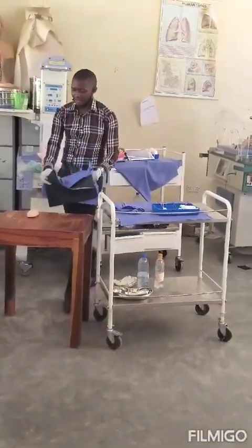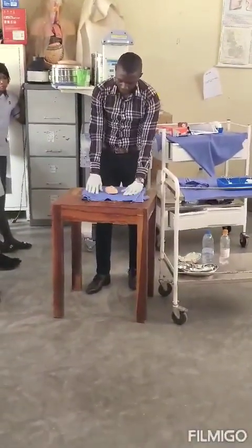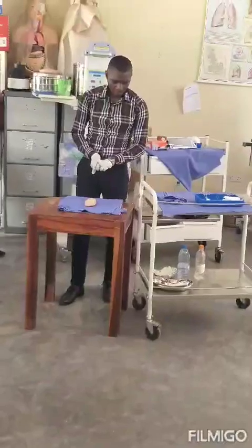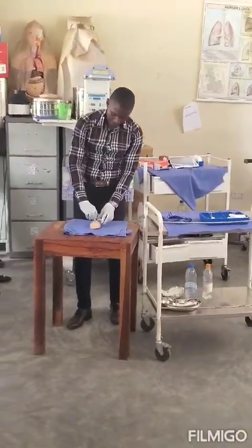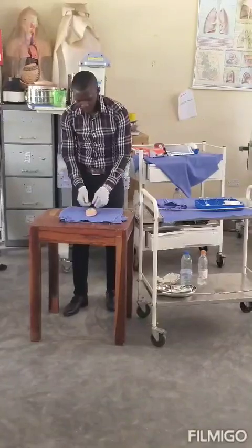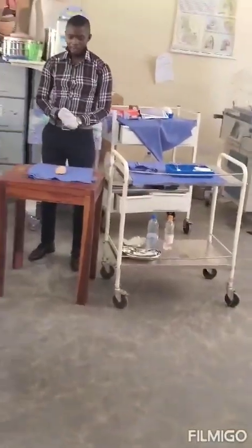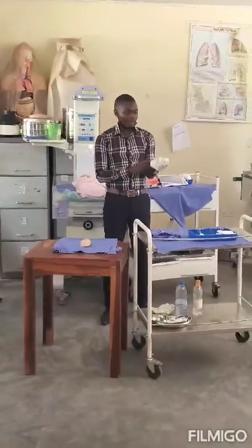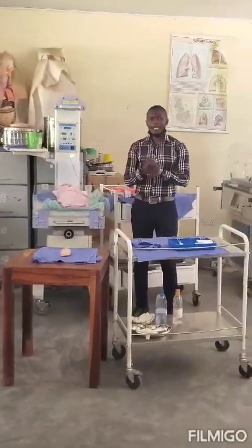You go to the patient and say, Mr. X, I'm back. I just want to place the Macintosh and draw sheet for comfort as well as to prevent soiling. I've screened to ensure privacy. And then if there's any gauze on the wound, you can remove it and say, okay, the wound is not bleeding that much and it doesn't look infected. Okay, Mr. X, I'll be back to do the procedure. Let me just prepare the instruments that I'm supposed to use. After permission, remove the examination gloves and get the sanitizer, sanitize.